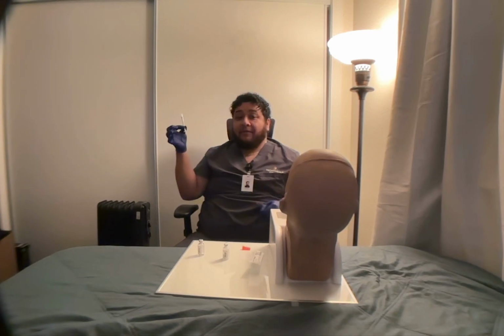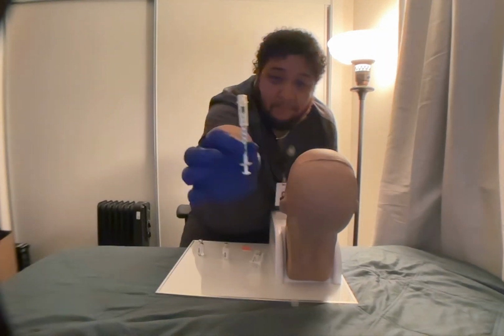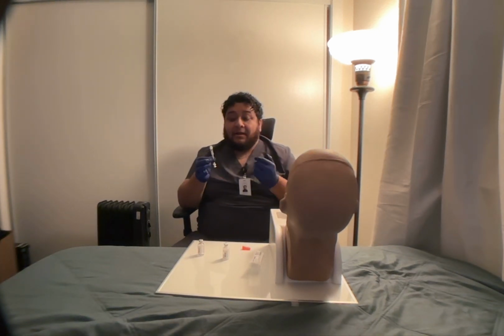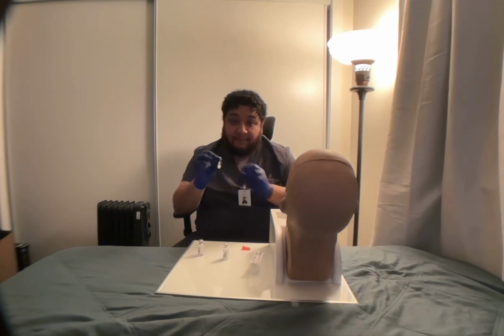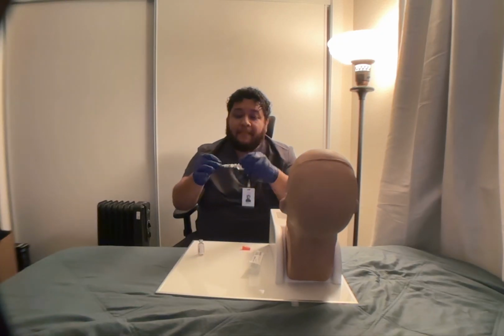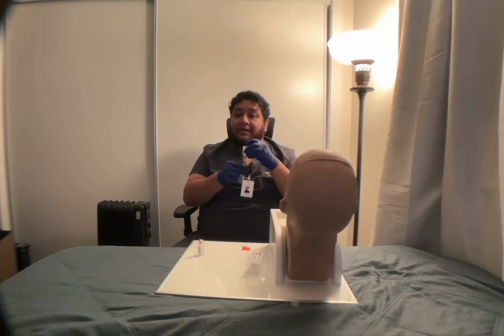Okay, I'm going to verify with the nurse and against the MAR, and show the camera real close. It's 4 units. Now I'm going to inject the syringe into the NPH vial. Now I'm going to invert and draw 8 units, totaling up to 12 units of insulin.